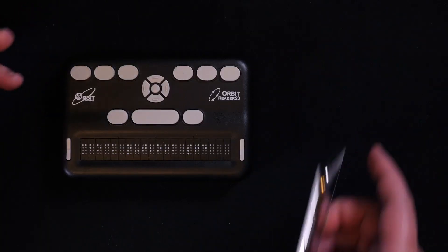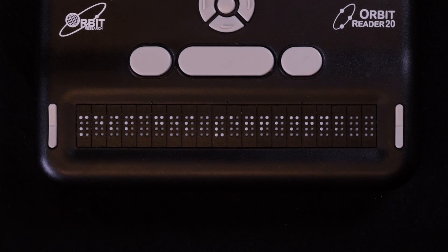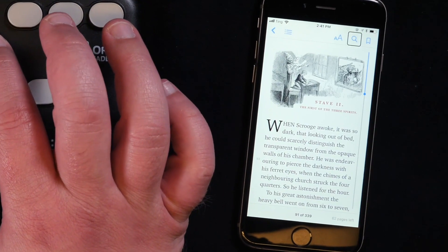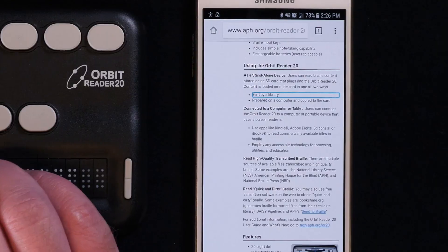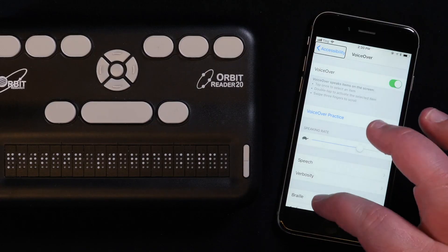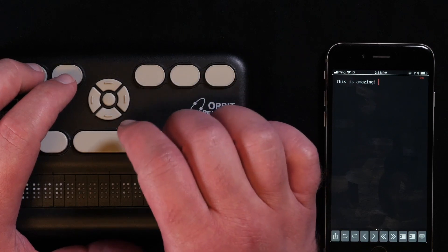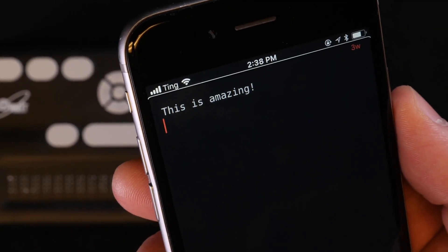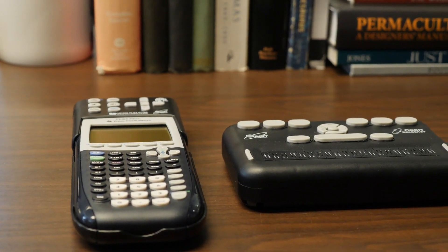When your Orbit Reader is connected to another device in Remote Mode, you can read books through Kindle, Adobe Digital Editions, or iBooks, or use any accessible technology for browsing the web, utilities, reading video captions and stored documents, and more. You can even connect it to an Orion TI-84 Plus talking graphing calculator.